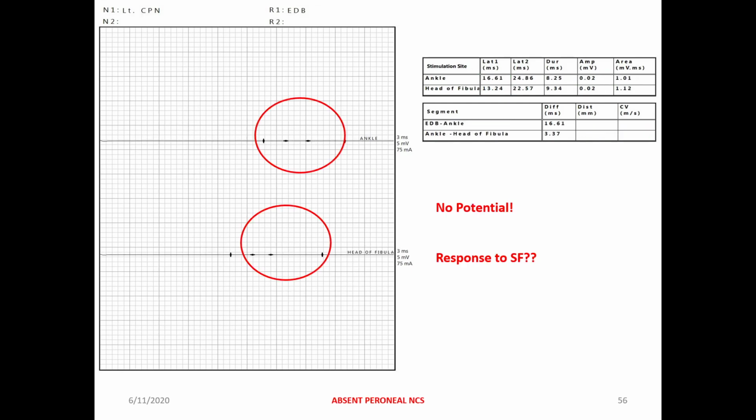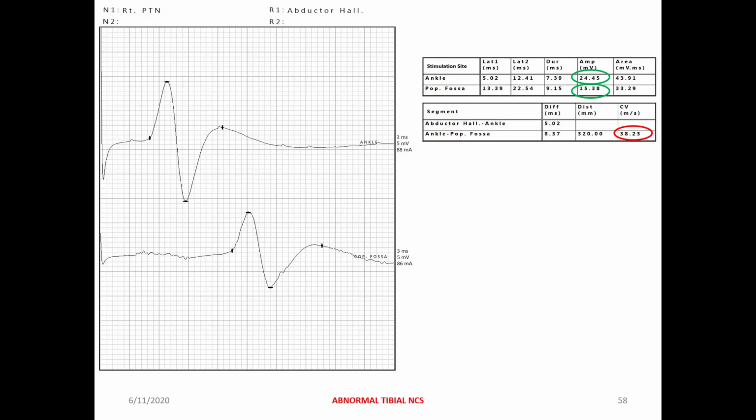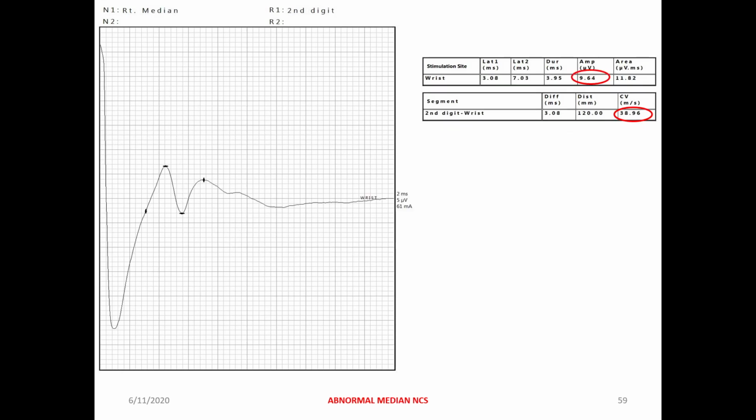Now we have also checked sensory median nerve. So amplitude, we discussed that it should be at least 20 microvolt. For motor 6 to 8 millivolt, for sensory at least 20 microvolt in general. Again I repeat, there are separate values for all the nerves, but still generally we are not always with the chart of these NCV values with us. So you can remember these values, roughly.